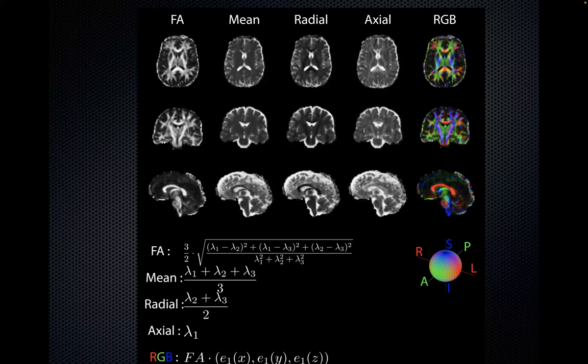So for a lot of people, less myelin means more radial diffusivity. If you have less myelin around the axons, you have less obstacle. It's easier to traverse radially.